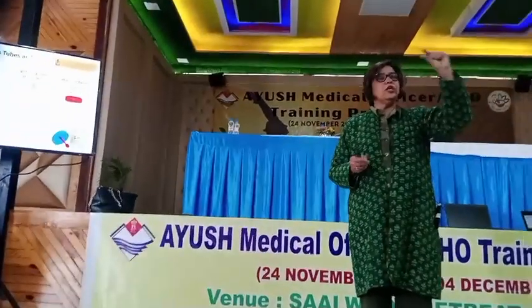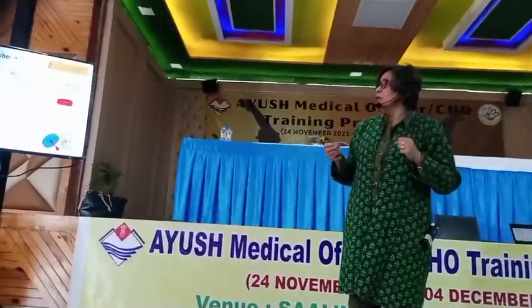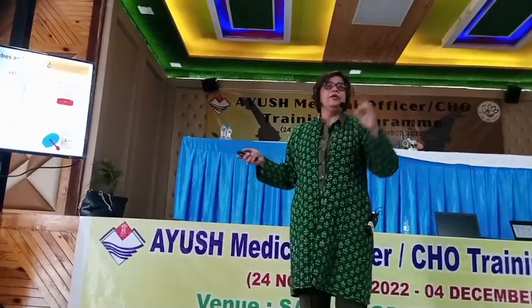This is the barrier tube which has a gel. If you have noticed, it is yellow in color, and the gel comes in it. Gel fastens the process of clotting. So this is the red tube. In the red tube, when we take a sample, or in the SST, serum comes out. I'm sure all of you know.